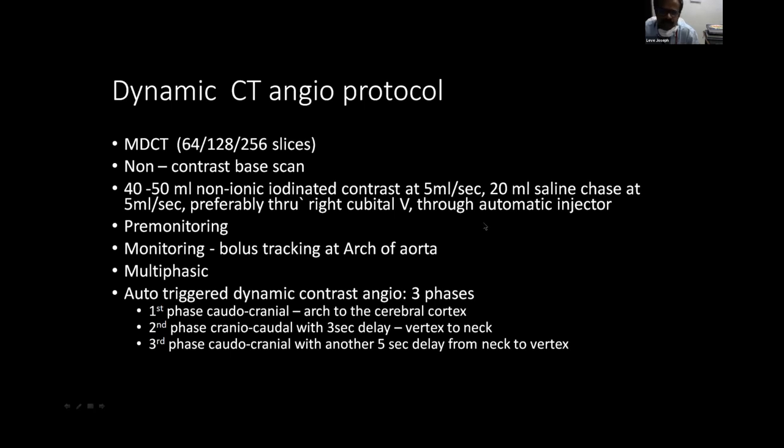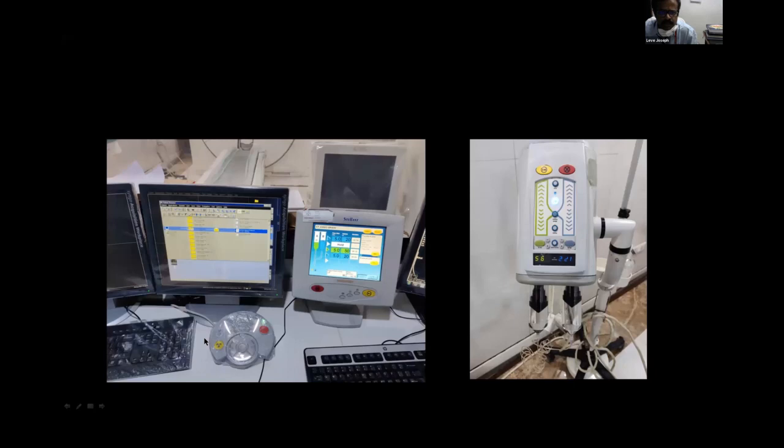Technically it involves pre-monitoring, that is the bolus tracking technique, which I may explain in the next slide. Typically, we acquire a multiphasic CT scan, at least 3 phases, suitably timed. I will explain the reasons also.